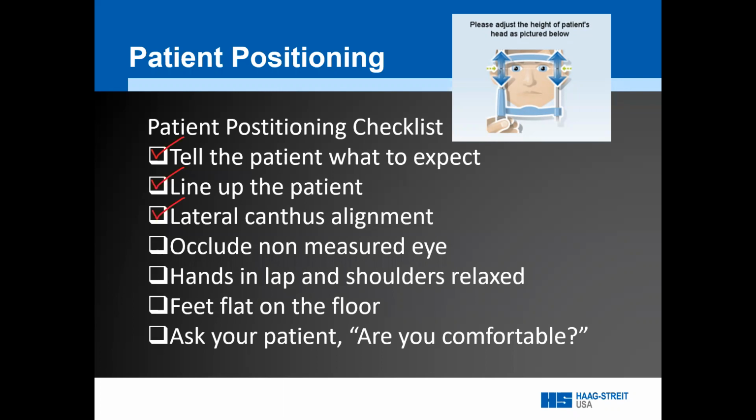The reason why this alignment is important is because it puts the patient in a really good starting position so that if they do move a little, they're more likely to stay inside of the range that the Lenstar can actually travel. If the patient moves outside of this range, it will only slow you down.